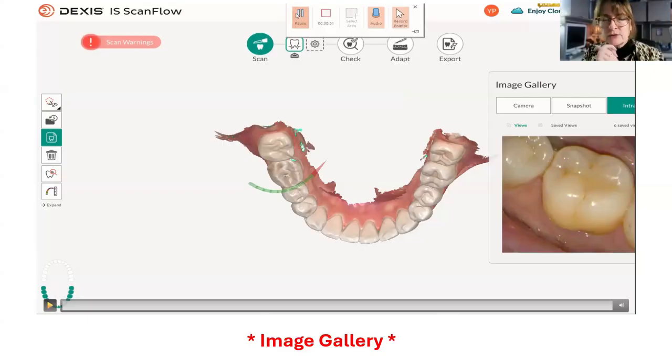I like to share a story about my husband, and Jessica's heard this numerous times, but we are so accustomed to trying to educate our patients with x-rays, right? As dental professionals, that's what we do. And my husband changed dentist, and he saw somebody that had an intraoral scanner. And the first thing they did when he arrived was they took a new patient record, right?